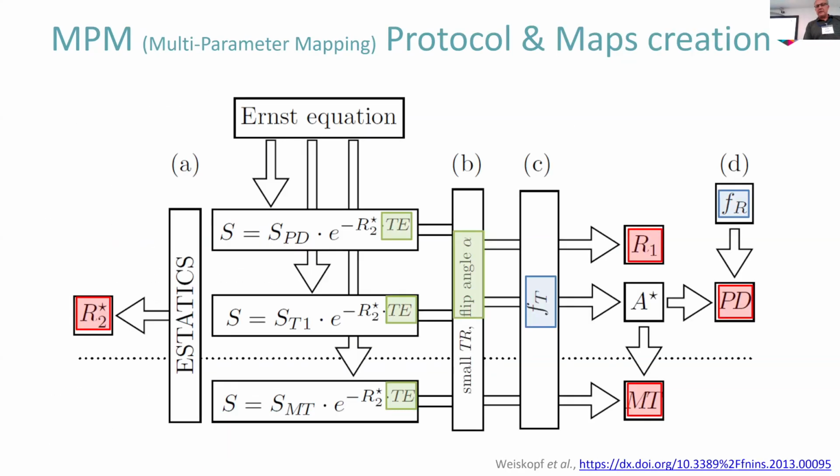And then we also need to model those B1 maps, the emission and reception of the antenna, to correct for the inhomogeneities. So we have to deal with the fact that the hardware, the coils, will not give us a flat sensitivity. There are places where the signal emitted or perceived will be higher or lower. So we have to account for that.